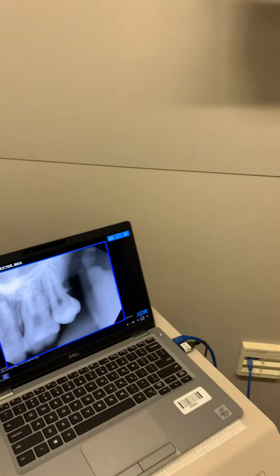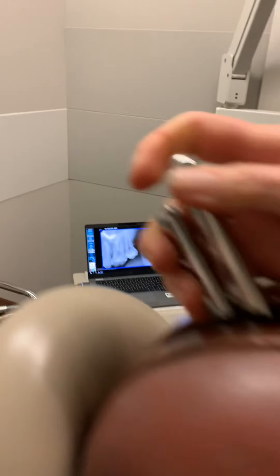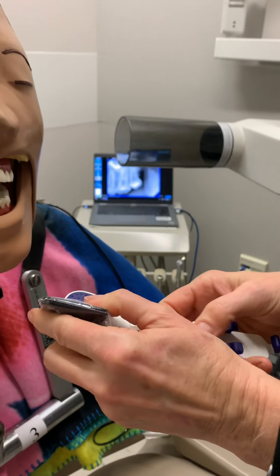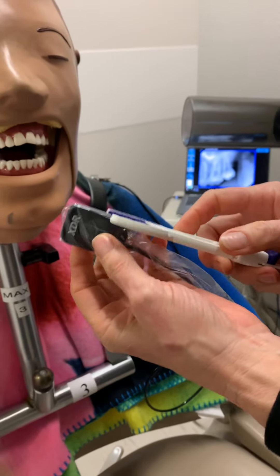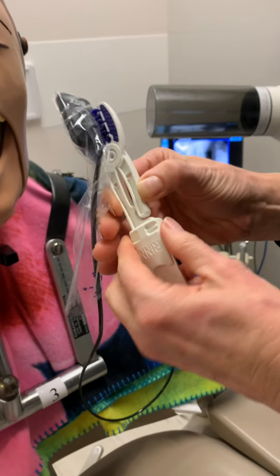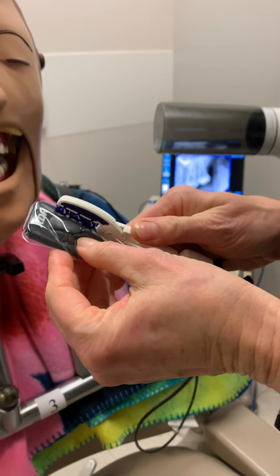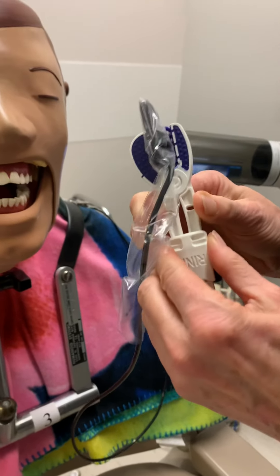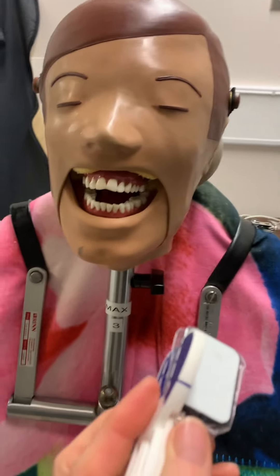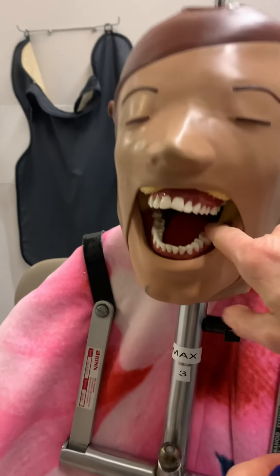Now we're going to drop down to the mandibular. I'm going to reposition my snap array, just need to make sure that it's level on the top there, and I'm going to tighten it up. That's one reason why we have these little clips here. Now I'm going to go down to tooth number 17.